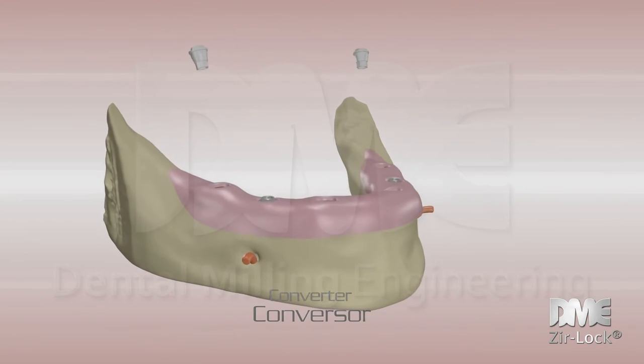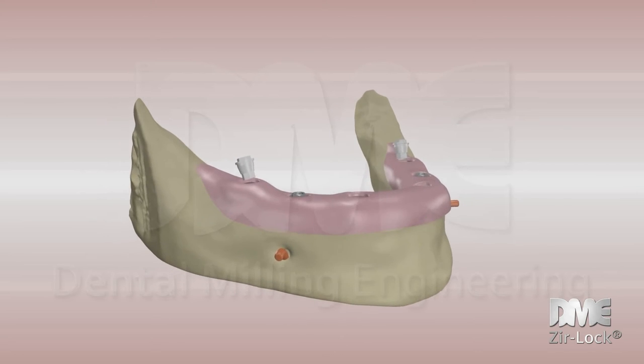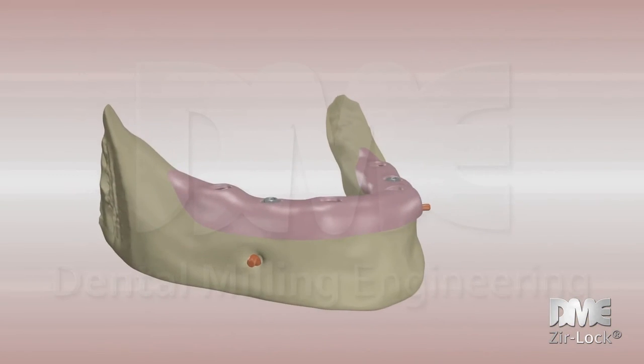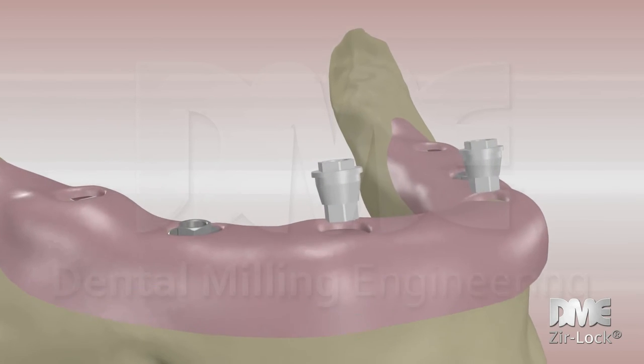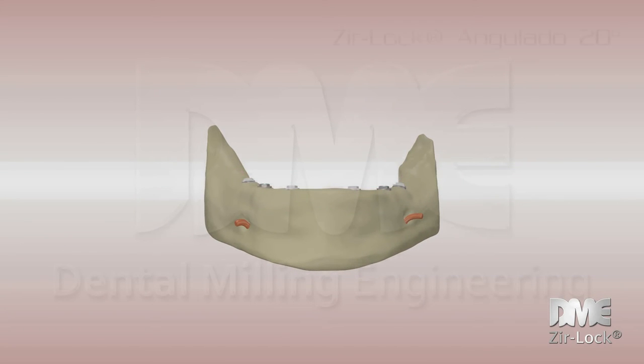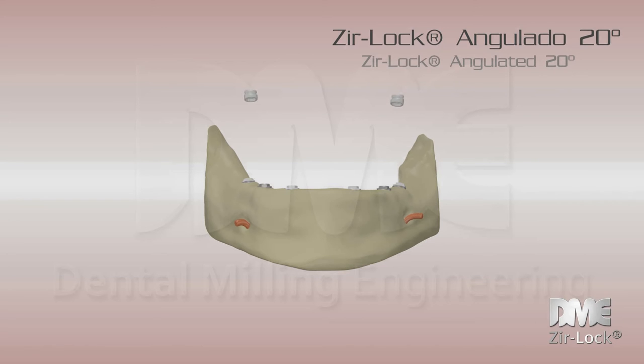As you can see, we proceed to place the converters. These attachments, classified as DMEIF, perform the function of transforming the internal connections into external ones. After this operation, we already have 6 implants with external connection format, so we could proceed to place the Zir-Lock. The laboratory has performed through the working model, measurements corresponding to the height of Zir-Lock and the angulation of the implant, so Zir-Lock could correct the discrepancies.